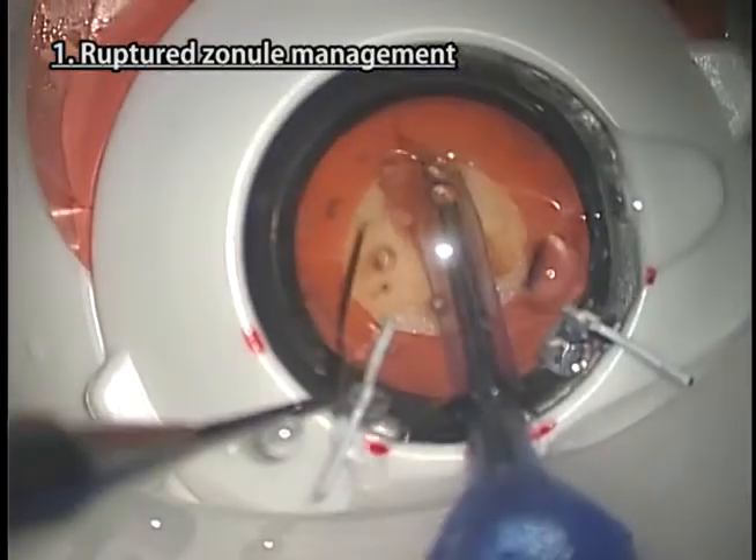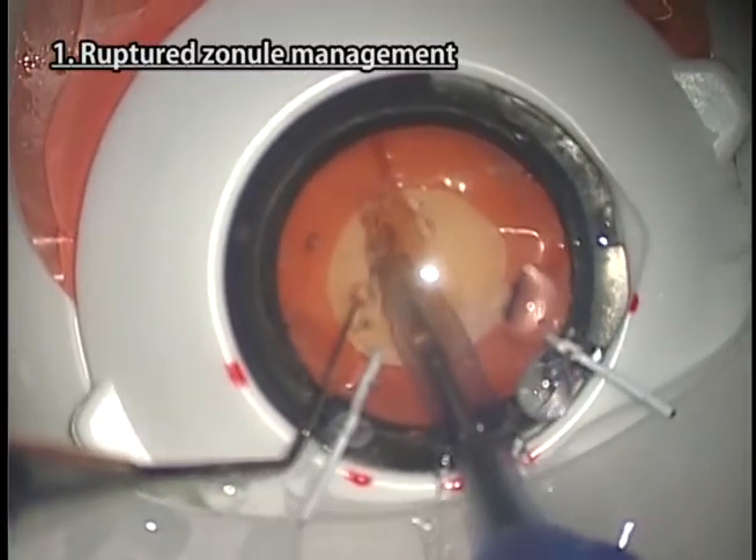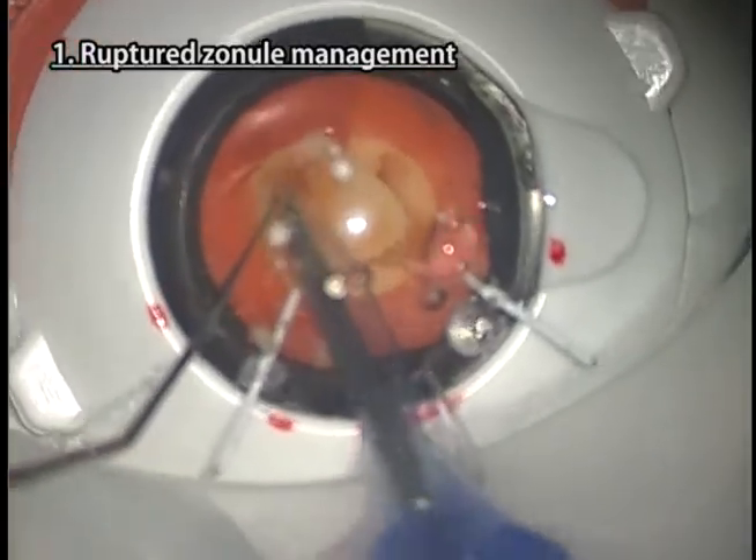Phacoemulsification should be performed while avoiding stress on the zonules. You can also practice installing the devices for supporting the capsular bag without performing phacoemulsification.